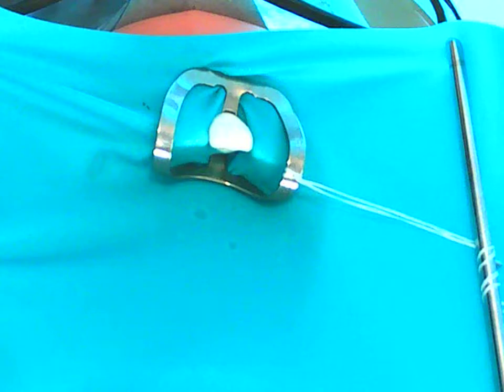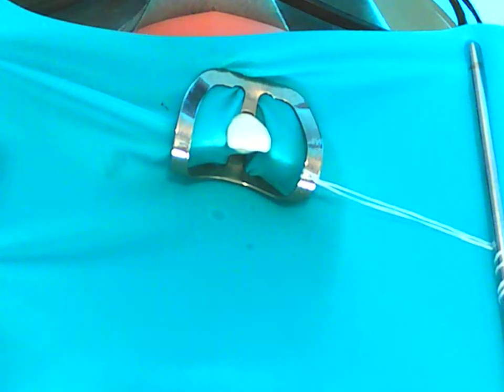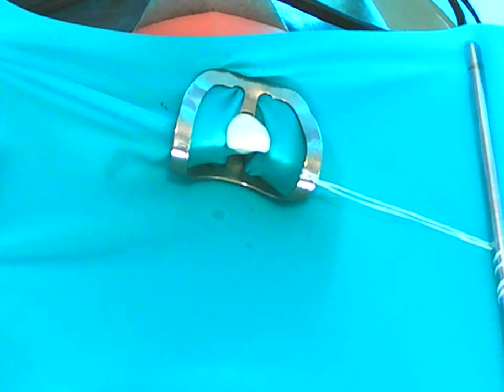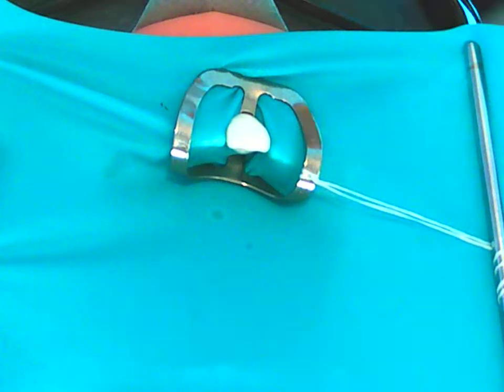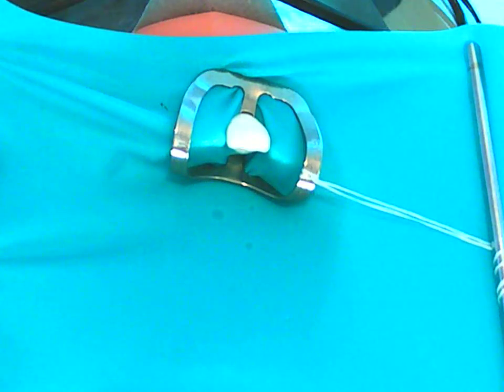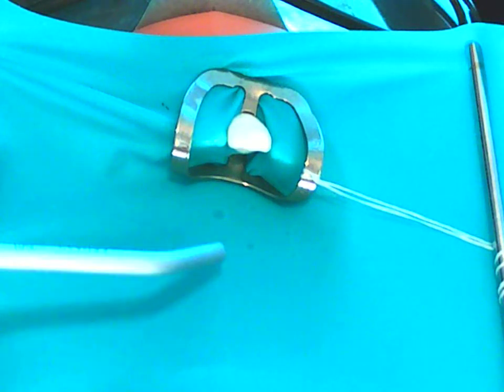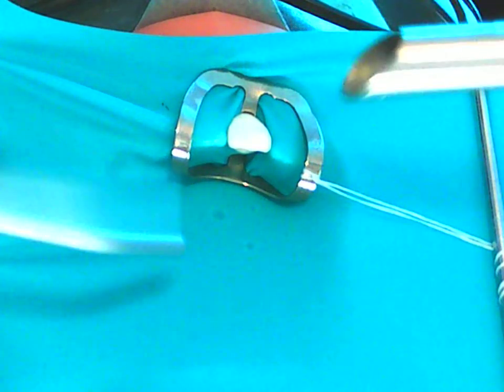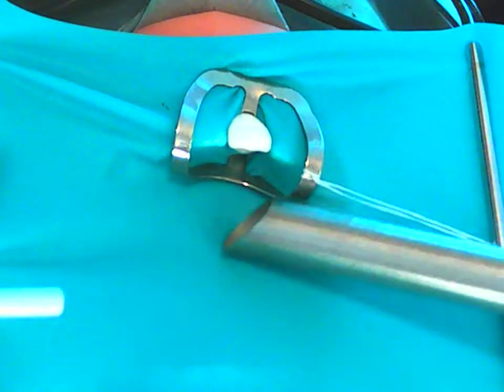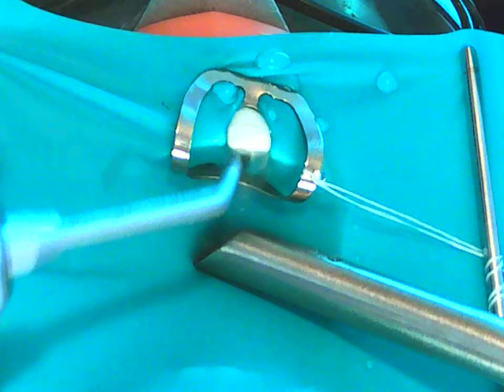Okay, the operator will come in and do the procedure, whether it be an endodontic treatment or a class 5 filling. And at the conclusion of that, you will make sure to rinse with the high volume evacuator in that area to ensure all the debris is gone. Rinse holding the air water syringe in your dominant hand, HVE in your non-dominant hand. Make your little trough. Give the water somewhere to go.